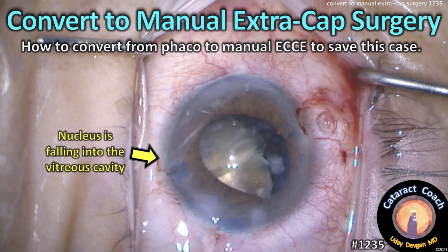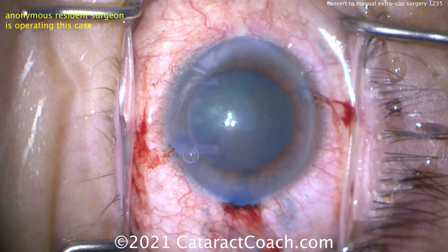CataractCoach.com. Do you know how to convert from FACO to manual extracapsular extraction? There are cases where you will have to know this to save your case.